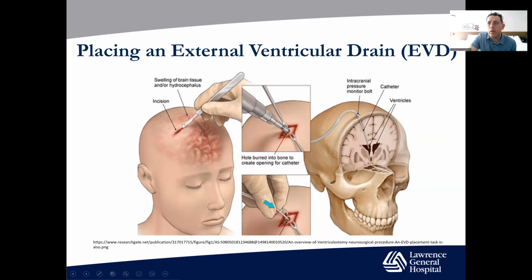And so the process would involve a small incision to get through the skin, and then to use a burr hole device. Now, this burr hole device will apply pressure and will start to screw through the skull. And then the second you reach negative pressure, or when you reach the dura, when there's a loss of pressure, it stops to prevent the device from going into the dura or into the brain. And then here we would place our particular catheter again into the lateral ventricle, usually on the right side.